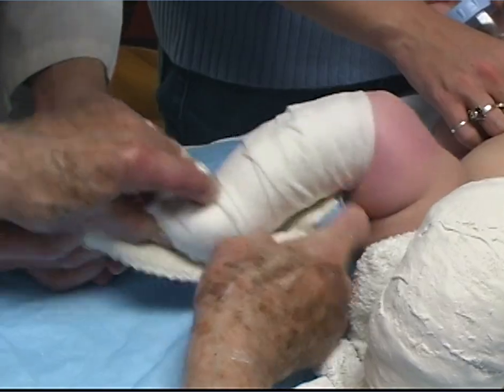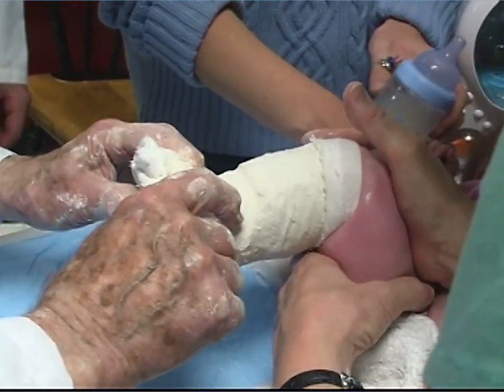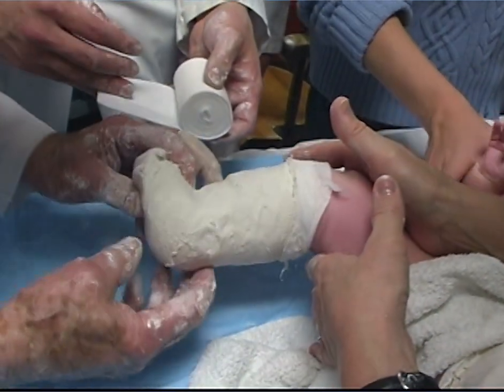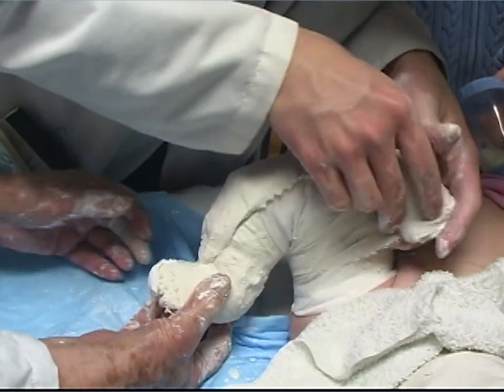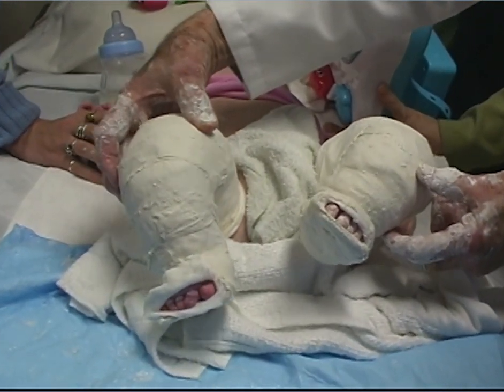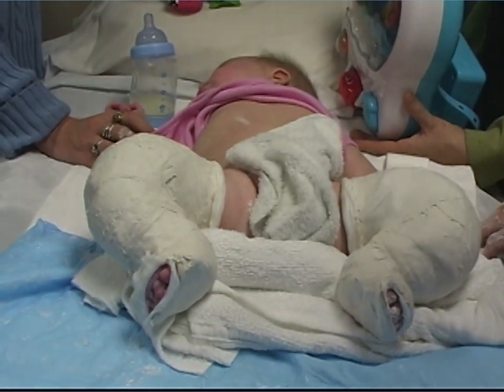A similar plaster cast was applied to the right foot. When dorsiflexing the foot, the orthopedist must see the toes — they often blanch from ischemia, but the blood returns when the pressure is decreased and the plaster sets. The cast held the feet straight in 5 degrees of dorsiflexion. After two more casts changed weekly, she wore a pre-molded foot abduction orthosis with the shoes in 30 degrees of outward rotation, 20 hours a day.